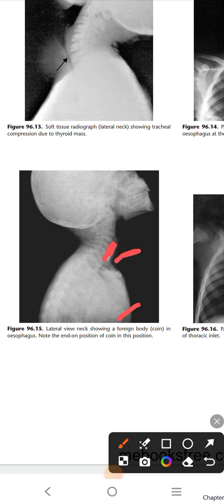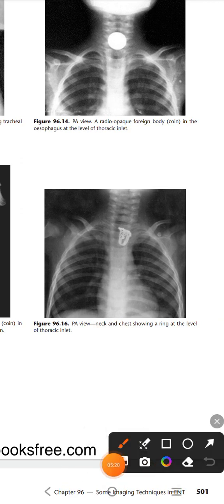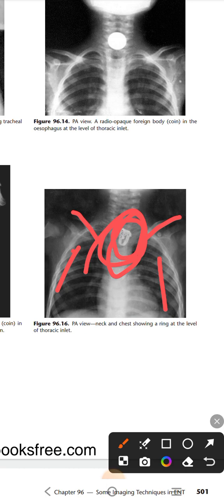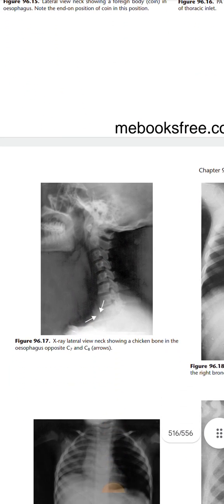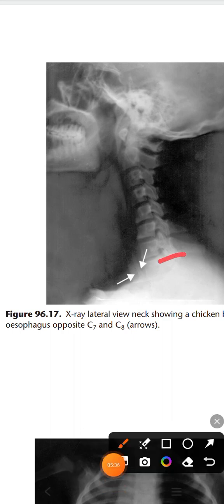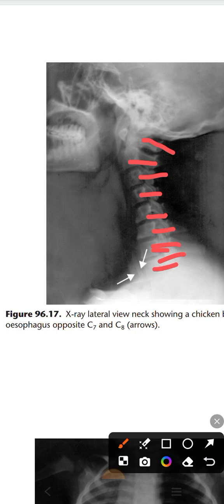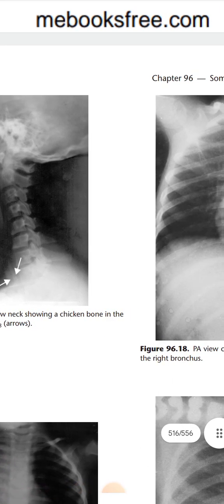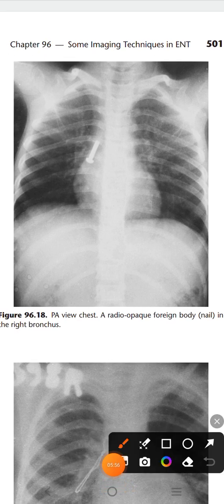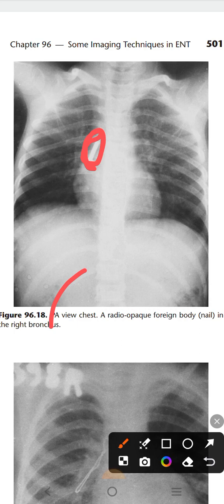Again, the lateral view of the neck shows a foreign body in the esophagus — it is not in the trachea, as the trachea shows black. In this PA view you can appreciate no scapular shadow, and a ring-shaped foreign body is present at the level of the thoracic inlet. Counting the vertebrae — one through eight — a foreign body is shown at the level of the seventh and eighth vertebrae in the esophagus, and this is a chicken bone. The next image shows a radio-opaque foreign body — a nail — seen in the right bronchus, again confirmed as a PA view since floating ribs are visible.